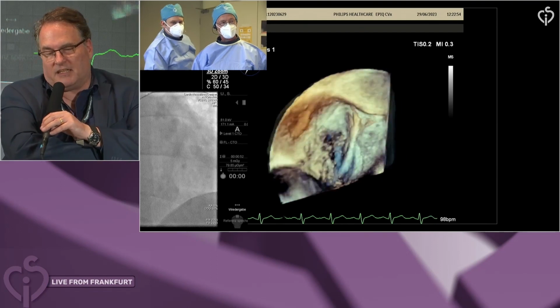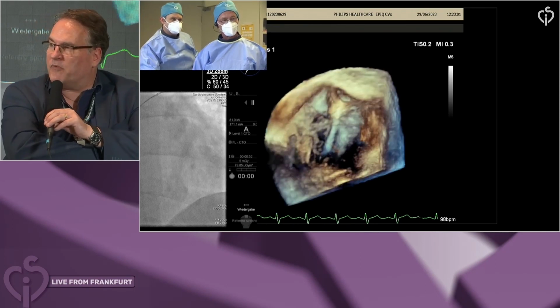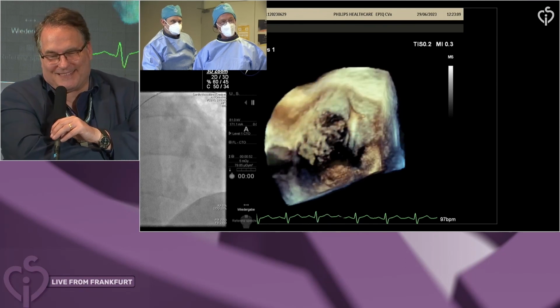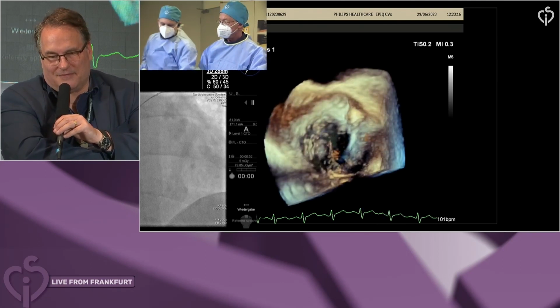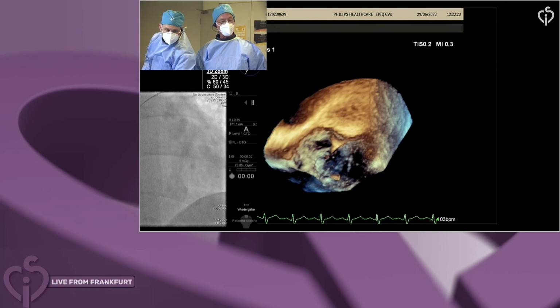And as far as we've seen from the first images, Busha was moving a little bit even into the membrane. I think this is a base of 12 millimeters, which will go very well with a standard device. But of course, we always wait for the wire for surprises. I'm currently pushing, and Busha, can you measure? I usually wouldn't do all these imaging techniques for a routine case, but just for demonstration. And again, if you start a PFO program, my recommendation is to do TE as well as balloon sizing.